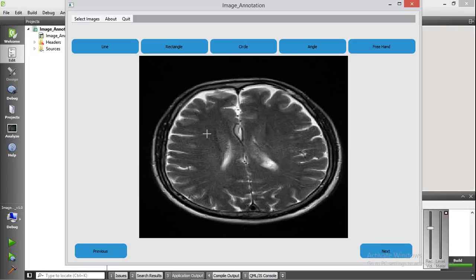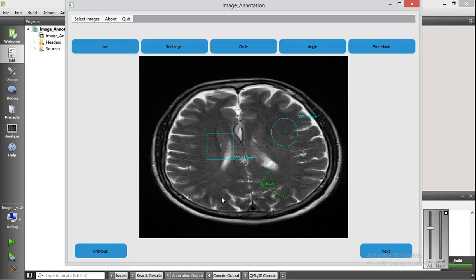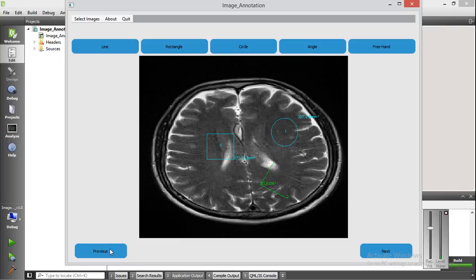I am annotating this image with a rectangle, a circle, and an angle. You can also go back to the previous image by clicking on previous.